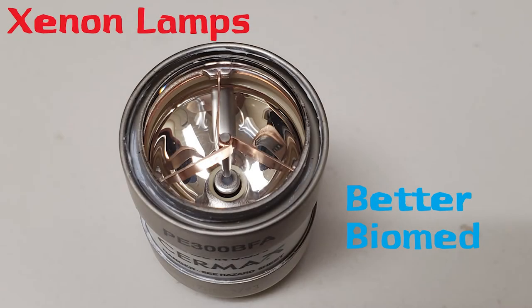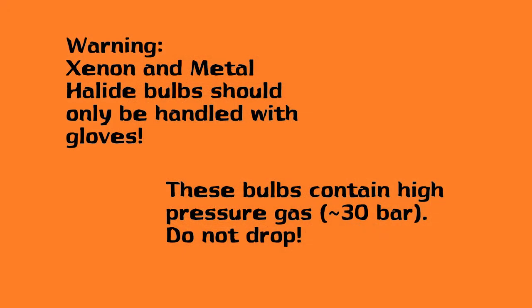Hello everyone, welcome back to Better Biomed. Today I'd like to go over xenon lamps and metal halide lamps. Before we get started, I'd like to warn you: xenon and metal halide bulbs should only be handled with gloves. These bulbs contain high pressure gas at about 30 bar, so please don't drop them — they'll shatter and explode.